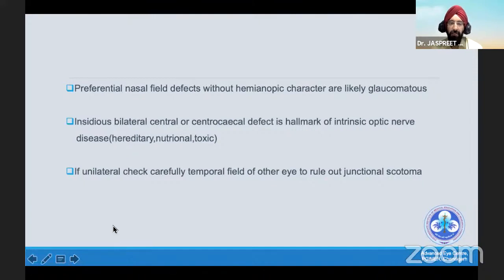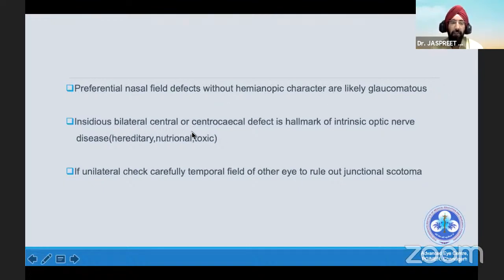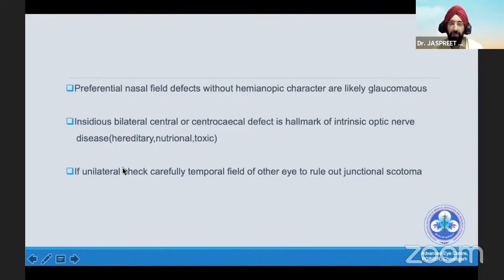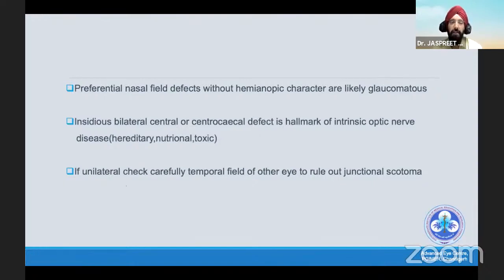Nasal field defects are very rare in neuro-ophthalmology; without hemianopic character they are likely glaucomatous, or could be optic nerve drusen as well. If you have an insidious bilateral central or centrocecal defect, that's the hallmark of intrinsic optic nerve disease, which could be hereditary, nutritional, or toxic. But if it is unilateral in neuro-ophthalmology, you always have to check the opposite field — you might be missing a temporal defect.